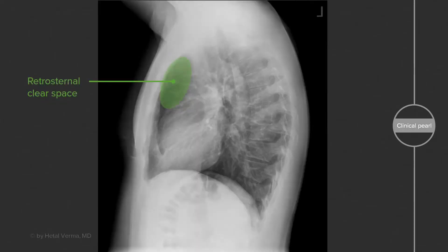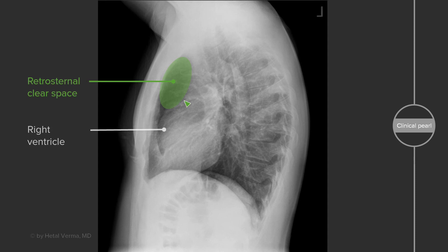It's still important to recognize the anatomy on this view, so let's take a look. We should have a retrosternal clear space. Right here we have the bony sternum, and then just behind it you should have an air-filled space between the sternum and the heart and mediastinum. The anterior aspect of the heart on the lateral view represents the right ventricle.